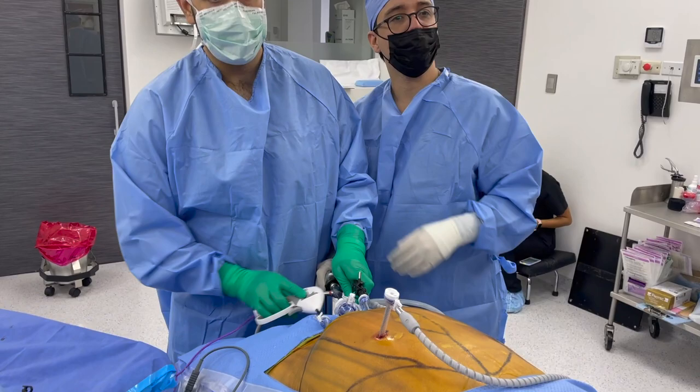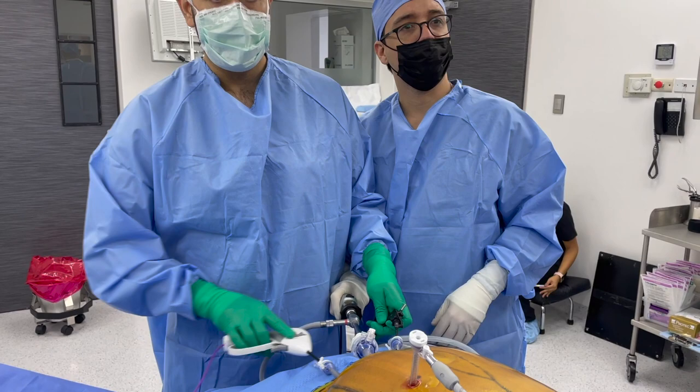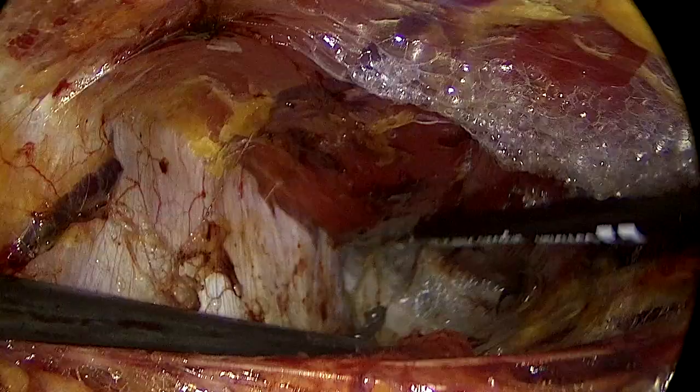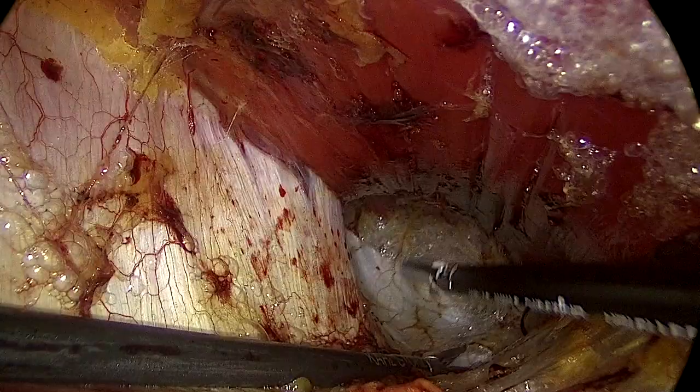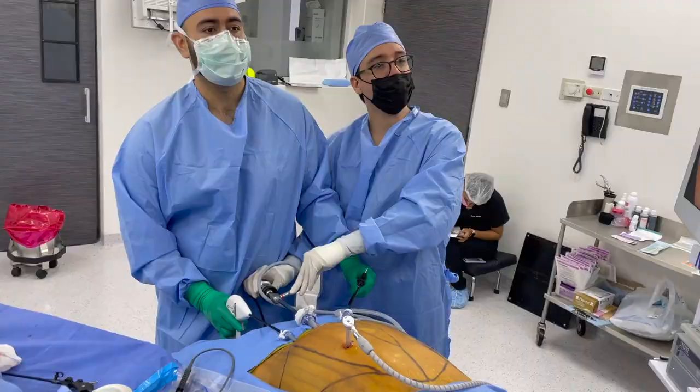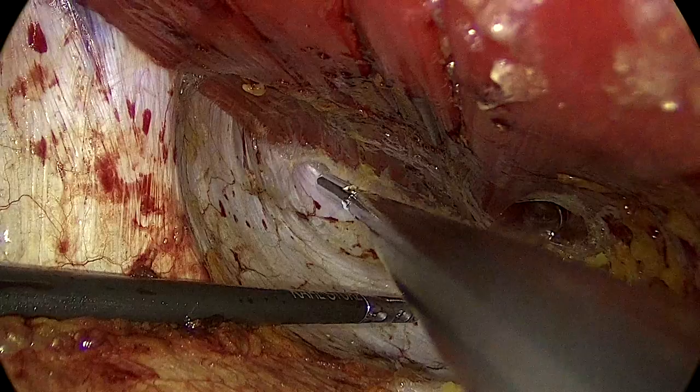This is the fashion in which I most of the time do it. I like doing the left retrorectus space first, because it's a space that I know has been previously developed, and it's easy for me to create this space in a safe way, making sure I don't have rents in the peritoneum. It is important to avoid having rents early in your case, because having an early pneumoperitoneum could be really frustrating — it can make the case difficult and will close your space.